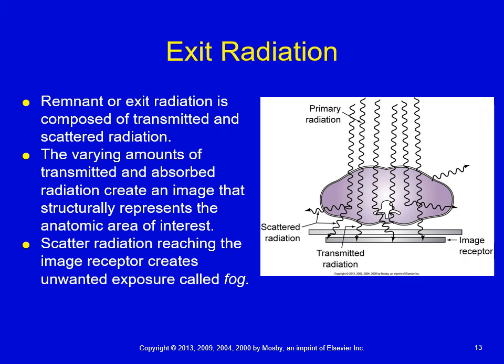This slide is trying to give us a visual of what is actually happening to those X-ray photons that actually make it through the patient. Basically, this is where the term exit radiation or remnant radiation comes in. Now, with X-ray production, some of the X-rays pass straight through the patient. There's a term that you need to look up, transmitted radiation. So transmitted radiation is what's needed to help create the image for us.